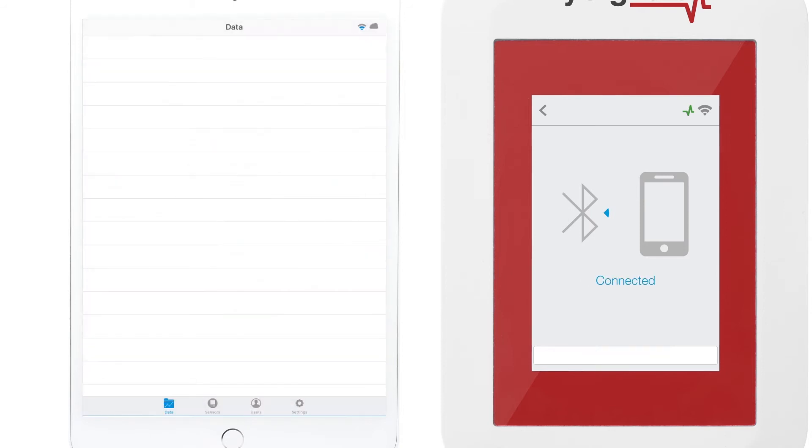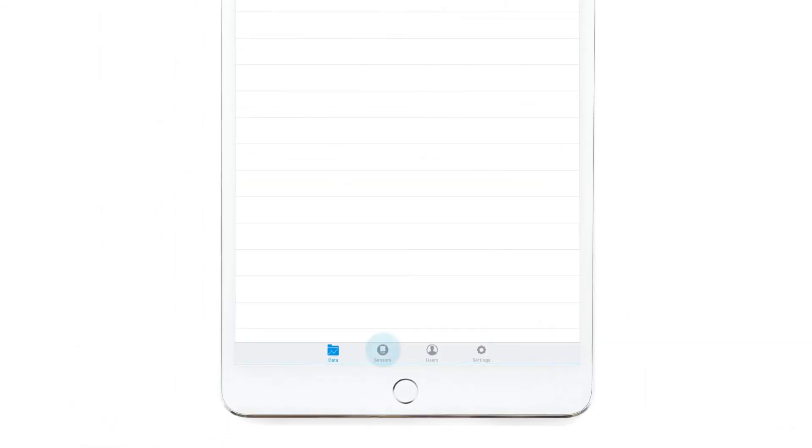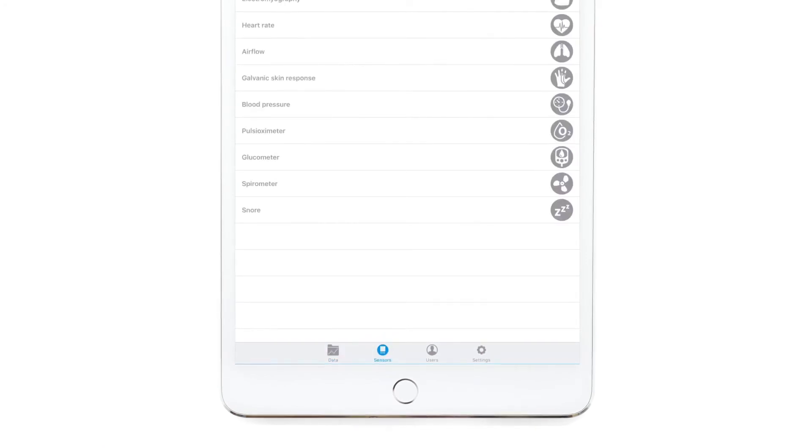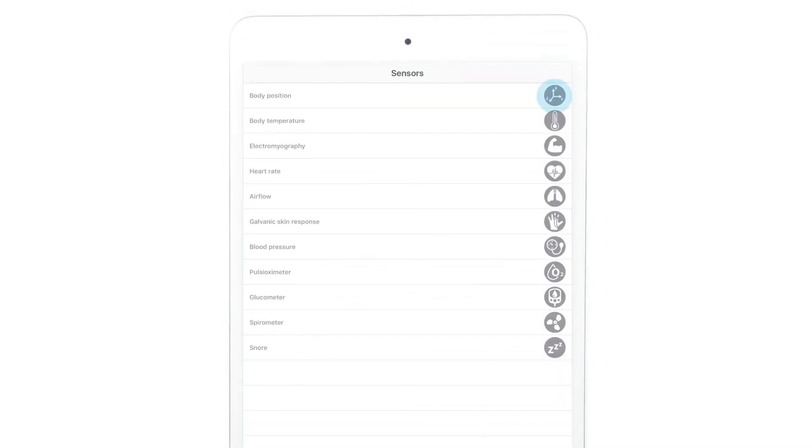After pairing the devices, the app opens in Data screen. Go to the Sensor Selection screen to choose the sensors you want to measure, and their icons will turn blue.